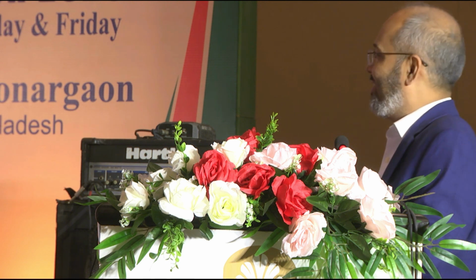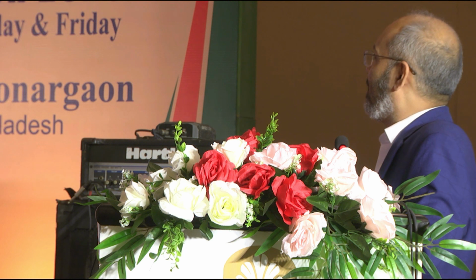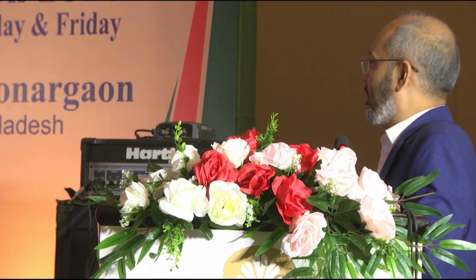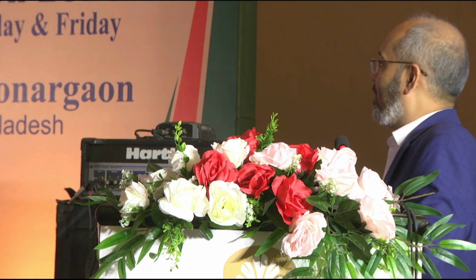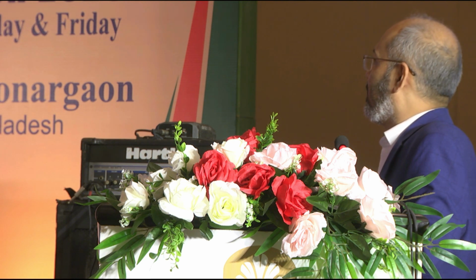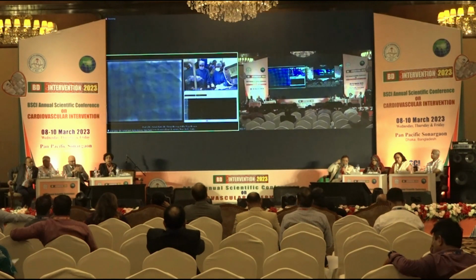We actually started, Fazila, good to hear you, and wonderful to have the first comments from you. We started the case early because we were... Of course, that's how live cases go. You have to start early. Totally agree. So would you care to tell us your strategy, or would you want us to guess? No, I don't think I want you to guess, because I guess everybody will have similar strategies, but it's more a point of discussion once I've set the strategy.